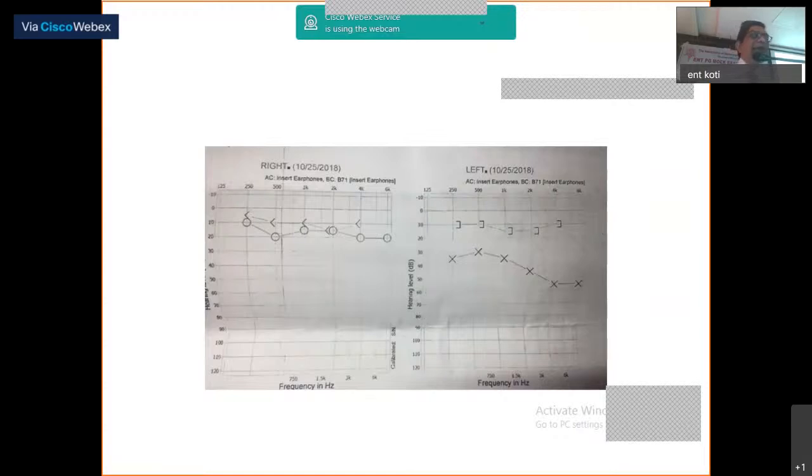So this audiometer has got two attenuators. Attenuators means increasing and decreasing the sound. Then it has got a sound generator which will generate sounds from 250 Hz usually, or even sometimes 125. Some of the audiometers can go up to 20,000, depending on the purpose you want. Most clinical audiometers have got sound generation from 125 Hz to 6,000 Hz or 8,000 Hz.